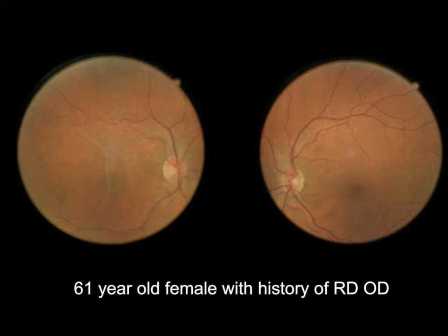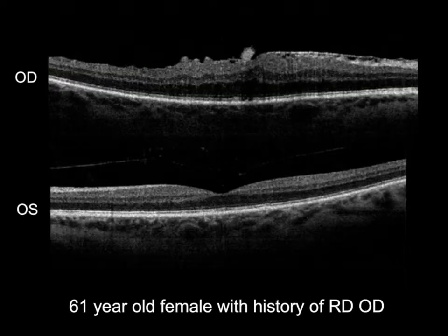One in particular is those individuals who have had a history of retinal detachment surgery, who have this almost kind of vitreous coalescing in front of the retina, like you can see here on the right-hand side of this individual. Now, when you take OCT scans on this individual, you actually see the irregularity that exists and the epiretinal membrane that exists as well. And these are conditions that we would have felt uncomfortable managing prior to OCT, just because we don't know what's happening or occurring to the retina.